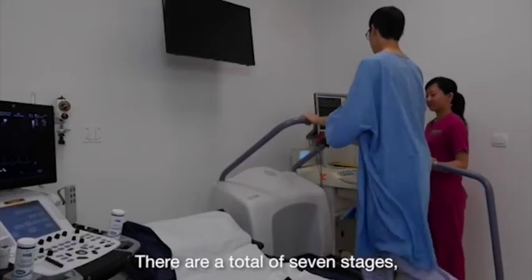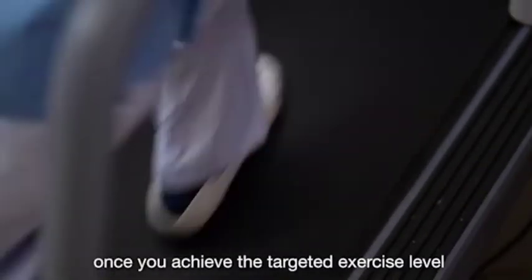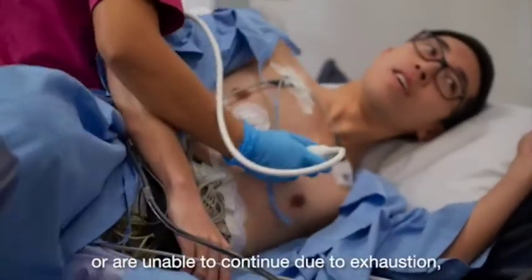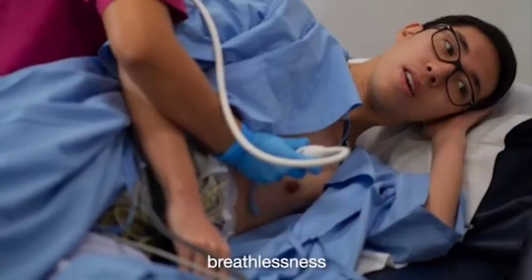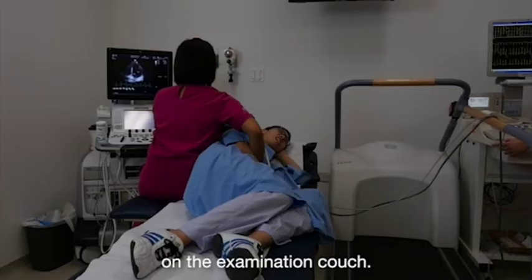There are a total of 7 stages. The higher the stage, the more strenuous it gets. The test will stop once you achieve the targeted exercise level or are unable to continue due to exhaustion, breathlessness, or chest pain. You will then be asked to lie down on your side on the examination couch.